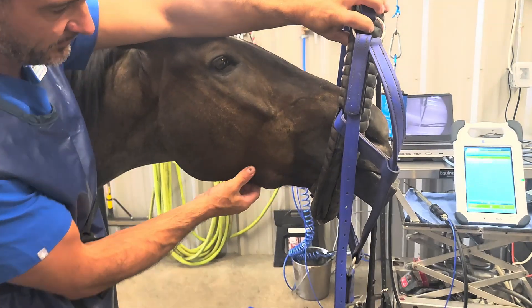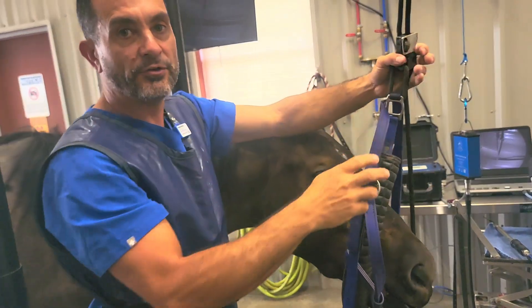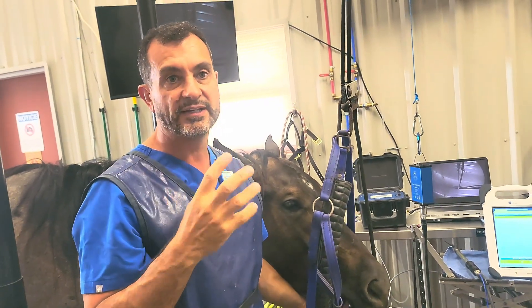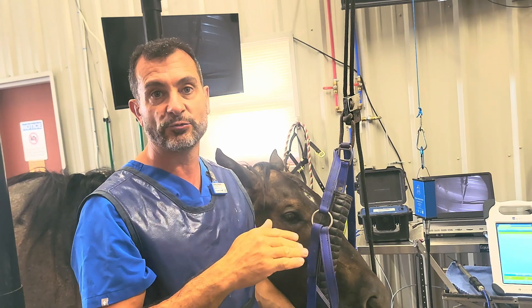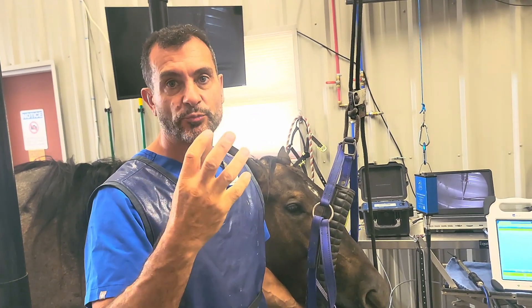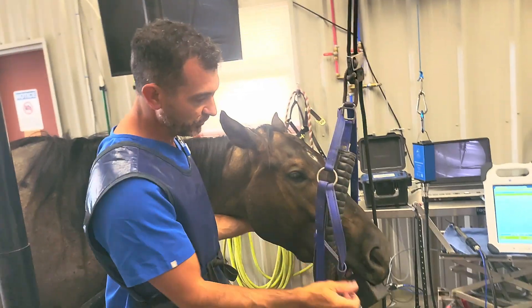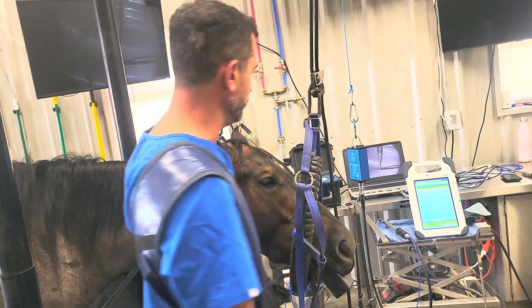We've got a horse here — he's a little jumpy and wobbly because he takes a lot of sedation — and we're going to show those views in a live scenario. We can see he has a big lump on the jaw, so that's the area of interest. It's very important that anytime a horse has a lump on the jaw or sudden difficulty eating, you want to make sure there's not a hairline undisplaced fracture of the mandible or maxilla. Always take a radiograph before putting a block or speculum in the mouth, because if there is a fracture you don't want to displace it further. We've already confirmed this isn't a fracture, so we have the block in and will take our views.